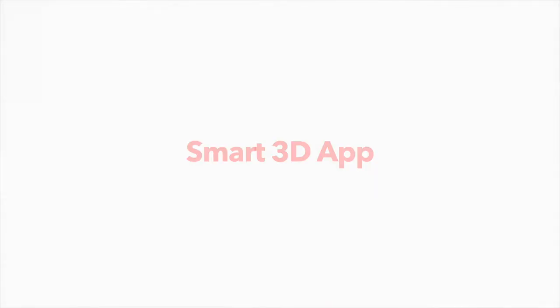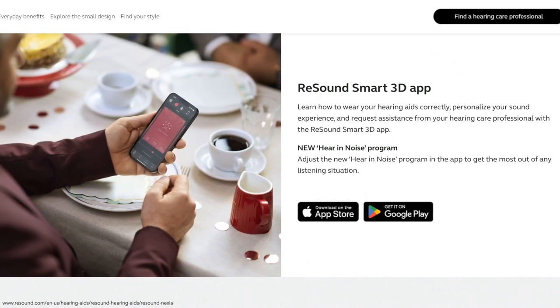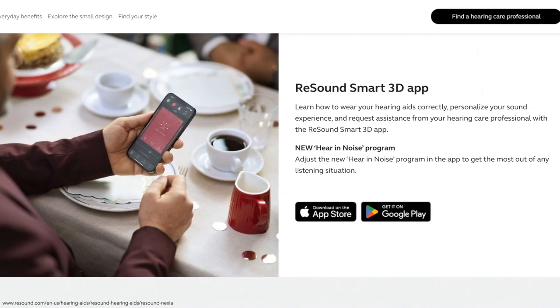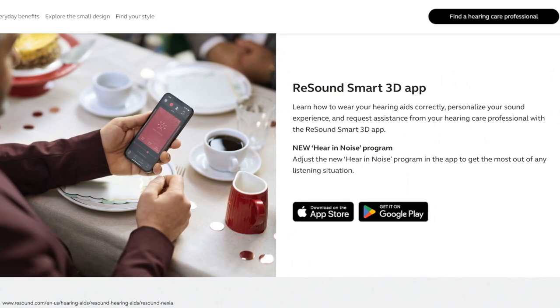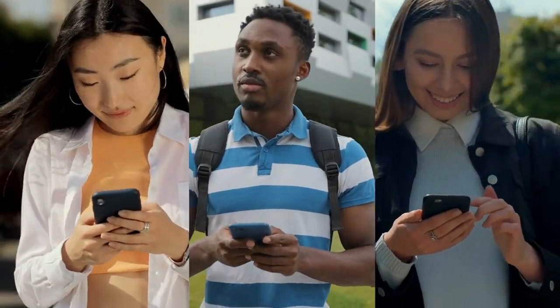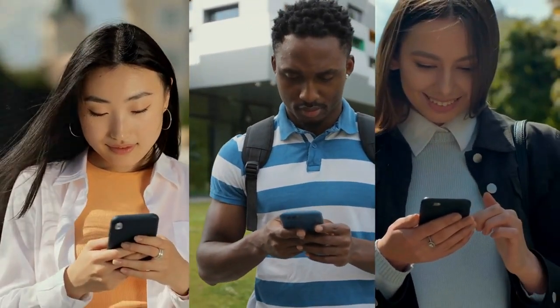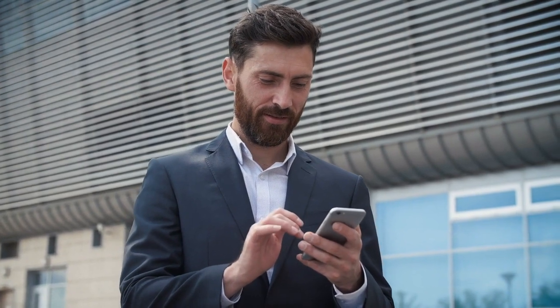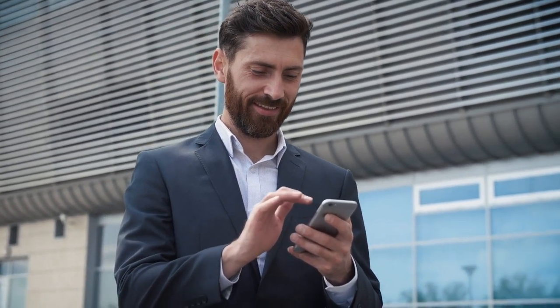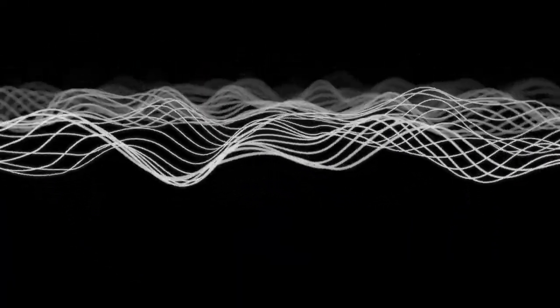For further customization of your sound settings and to control your ReSound Nexia hearing aids, pair them with the ReSound Smart 3D App. This app allows you to make quick adjustments, save favorite settings, and request remote fine-tuning from your provider with ReSound Assist. You can also customize tinnitus masking sounds, save location-based hearing aid settings, track your hearing aids if you lose them, and access a new Hear in Noise program for better hearing in noisy situations.